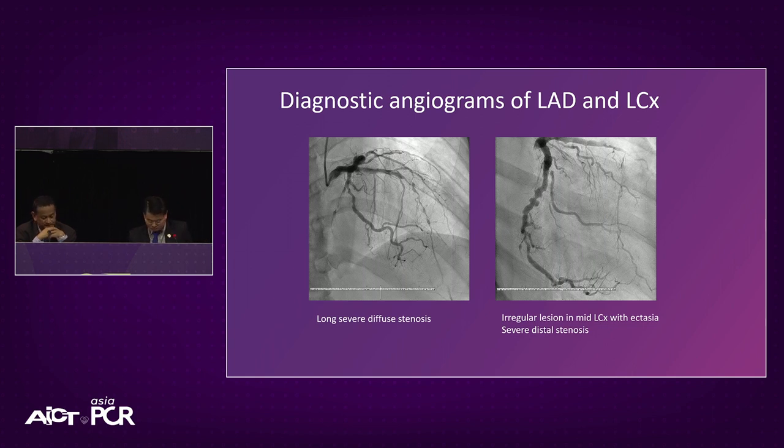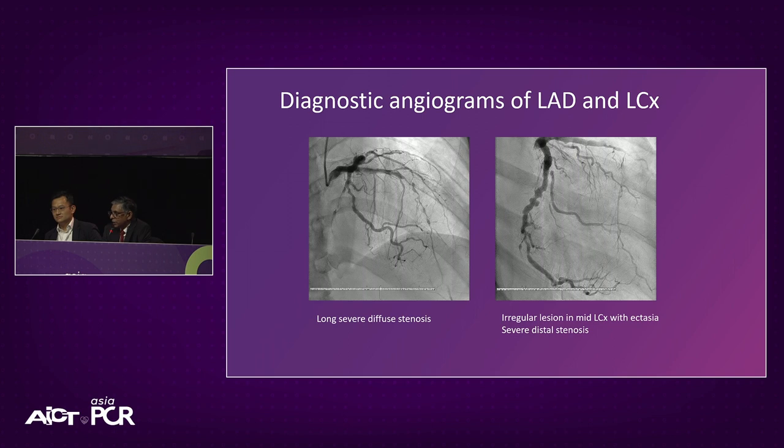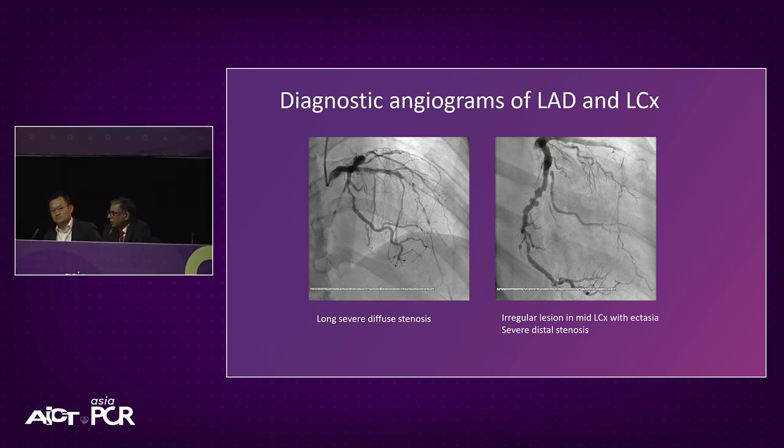I mean, yes, by definition it is, but in terms of where you're going to see an inflection point in outcomes, it's really the 2.5 and below, where there's a significant difference in outcomes. Do you have evidence to back that up, to say 2.5 is worse outcomes? Yeah, so as I said, vessels below 2.5 are where you start seeing more restenosis. For obvious reasons, you don't get a good luminal area to begin with, and then there's an obligatory loss of lumen with the neo-intimal hyperplasia, and you do see more restenosis in that group.